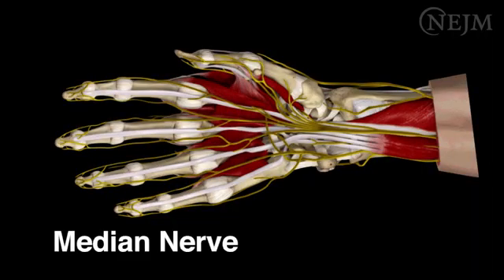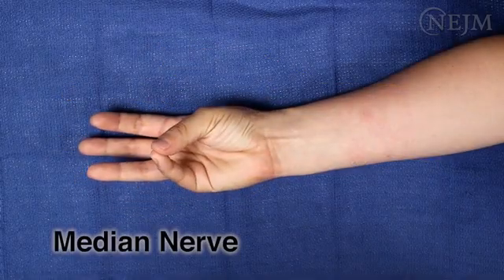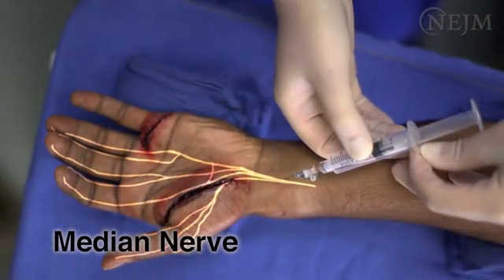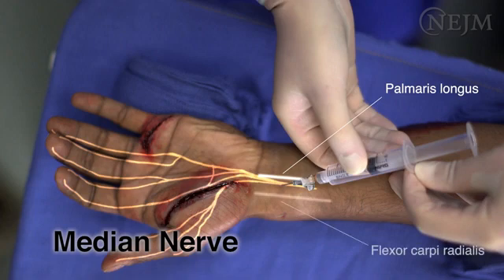To block the median nerve, first identify the palmaris longus. To do so, it can be helpful to have the patient oppose the thumb to the 5th digit while flexing at the wrist. This should make the tendon appear more prominent. Insert a 25 or 27 gauge safety needle, 2.5 centimeters proximal to the wrist crease, between the tendons of the palmaris longus and the flexor carpi radialis.